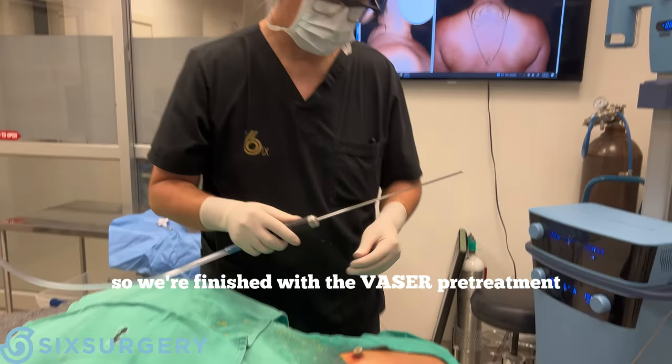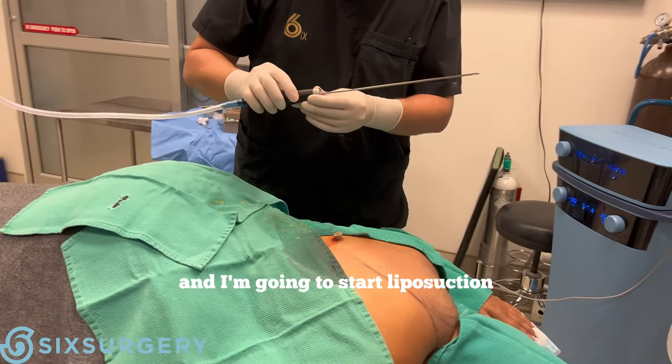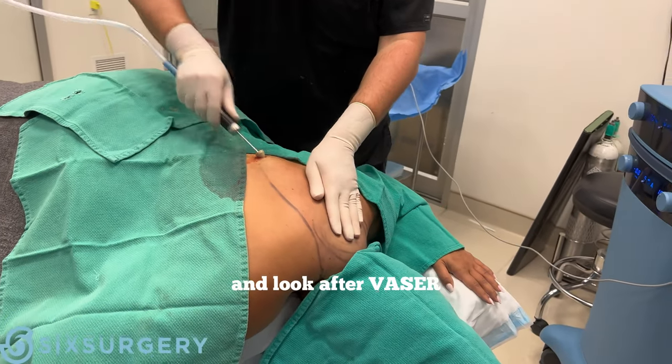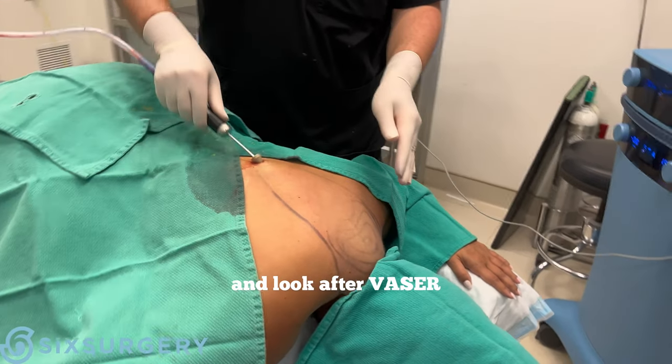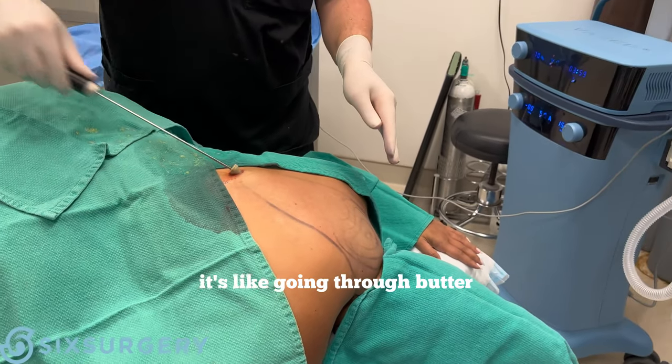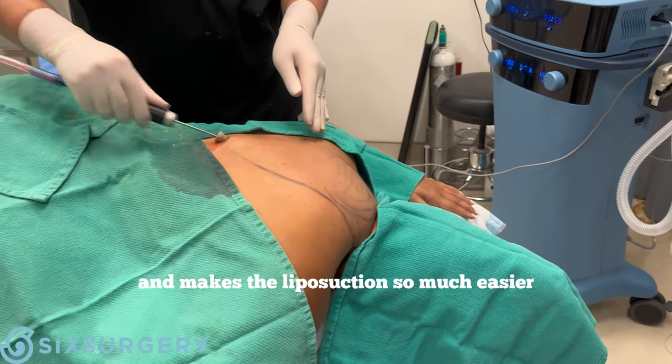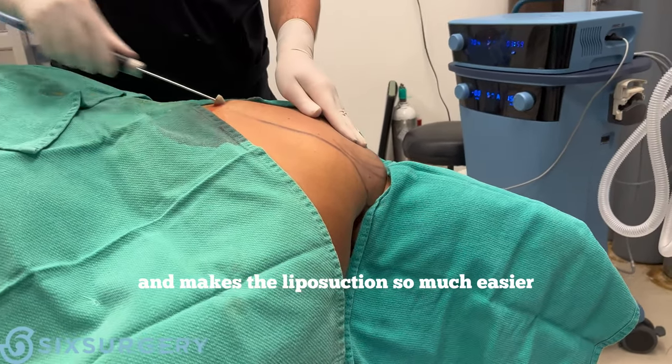We're finished with the VASER pre-treatment. Now I'm going to go ahead and start liposuction. After VASER, it's like going through butter — that's the beauty of VASER. It breaks up the fat and makes the liposuction so much easier.